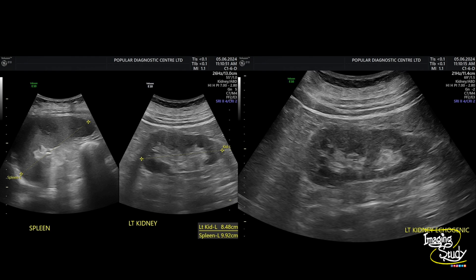Here's the left side view. You can see the spleen is quite normal in length. The left kidney is also slightly echogenic. Let's see on real time.